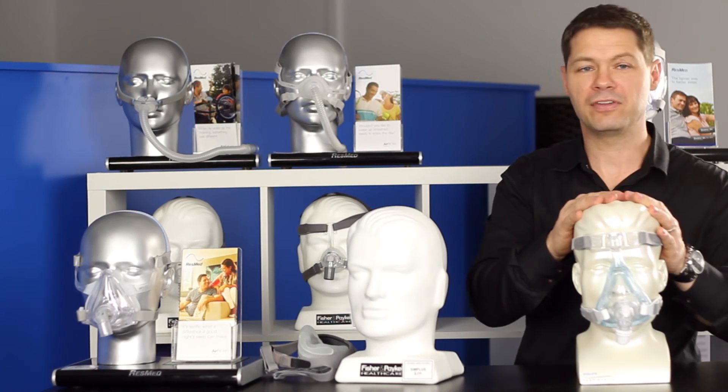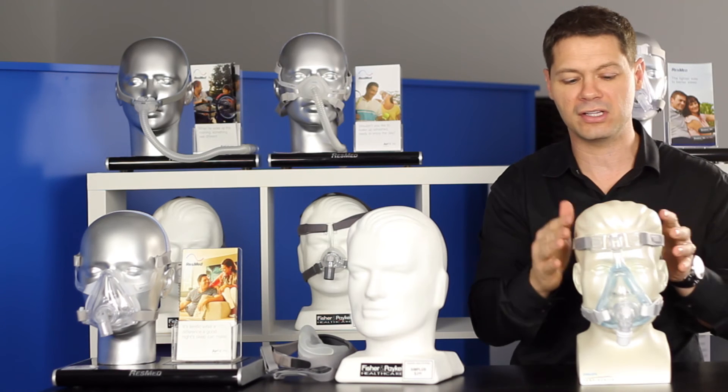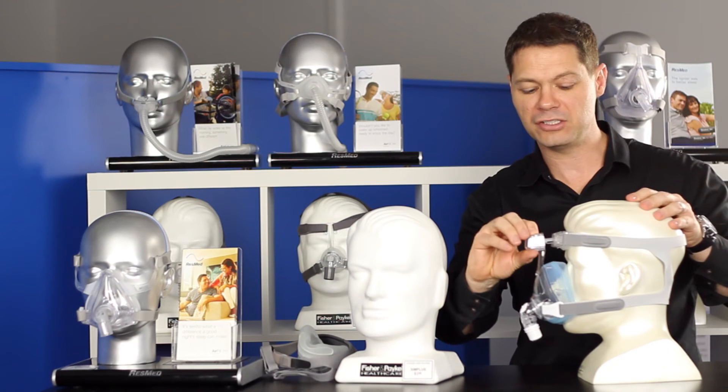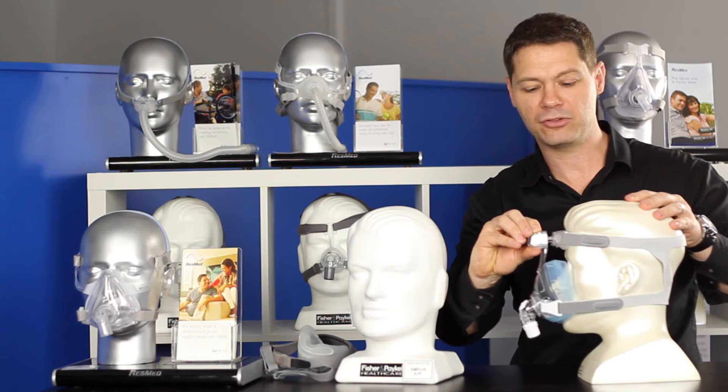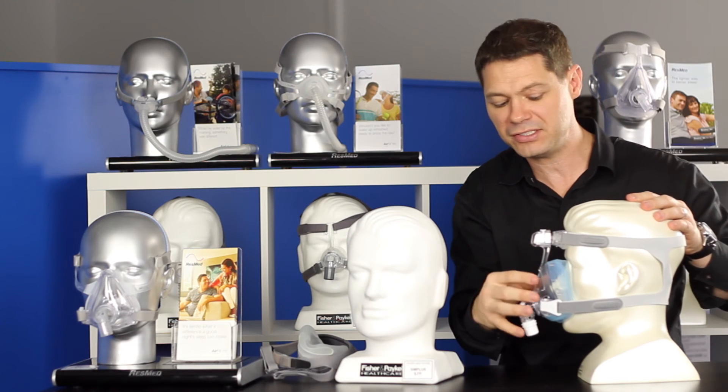Lastly, the Philips Respironics gel mask — this is the Amara, the same headgear and the same frame as the old Amara. So it has adjustable headgear up the top and a forehead support, which allows you to adjust the profile of the mask as it sits on the face.